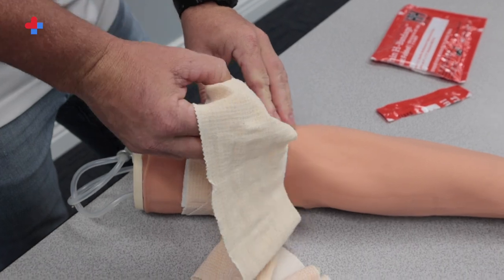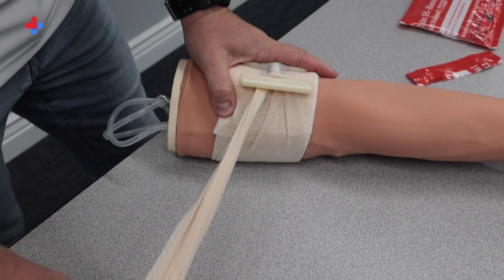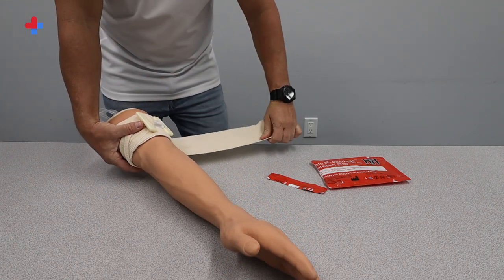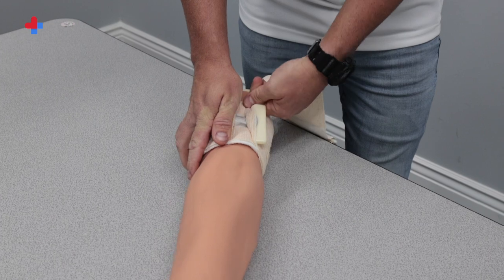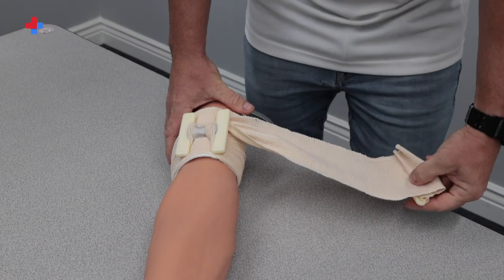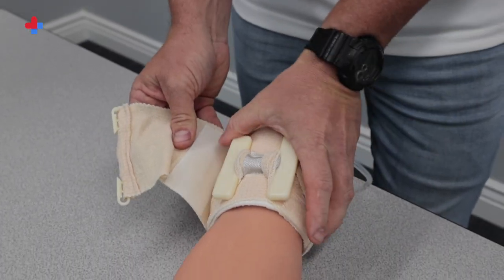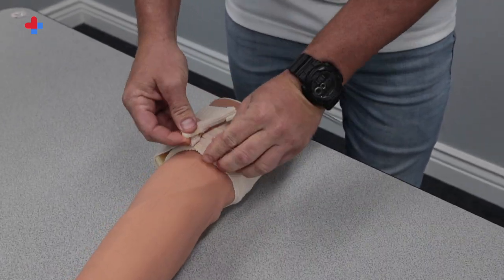Once you've done this, loop the bandage around one of the H bars. Hold the H to keep it from slipping and give the bandage a firm pull. This will begin applying direct pressure over the wound area. Now wrap the elastic bandage back under the extremity and wrap it around the other side of the H bar, then pull the bandage. This dramatically increases the applied pressure. At this point you can let go — the bandage is secure. You can stop here or continue to wrap the bandage around the wound. Once you reach the end, there is another strip of velcro and two clips to attach the end of the wrapped bandage.